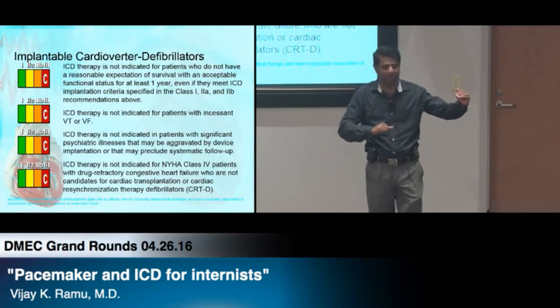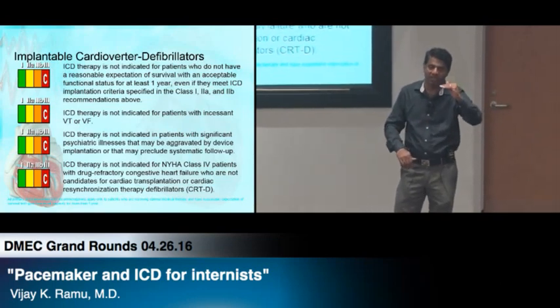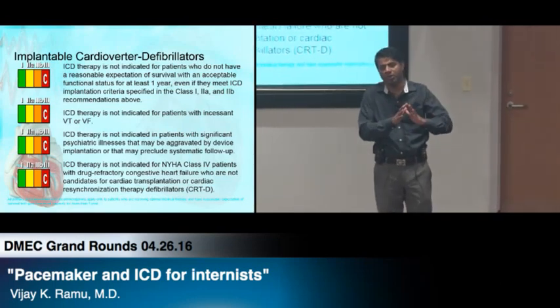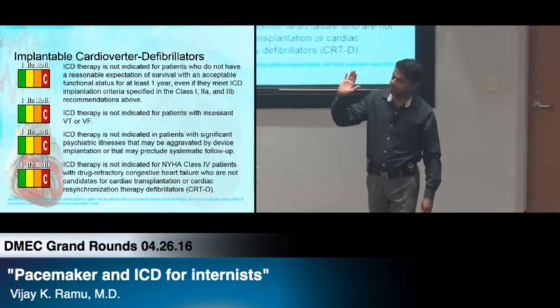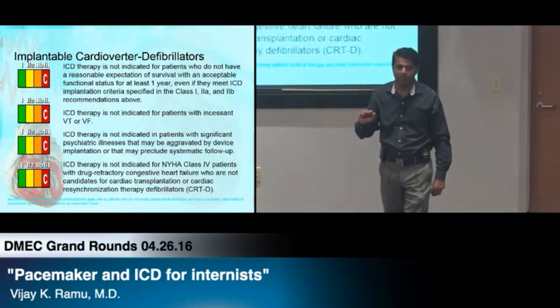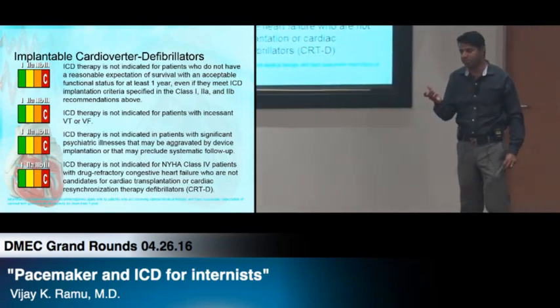So aspirin, Plavix, I never worry about it. Coumadin, if it is a simple indication, I stop it and do it. However, if it's a mechanical valve, I put the ICD in through the Coumadin. You can put it in. Actually, the CT surgeons are the ones who are scared. Most of the EP people will do it.